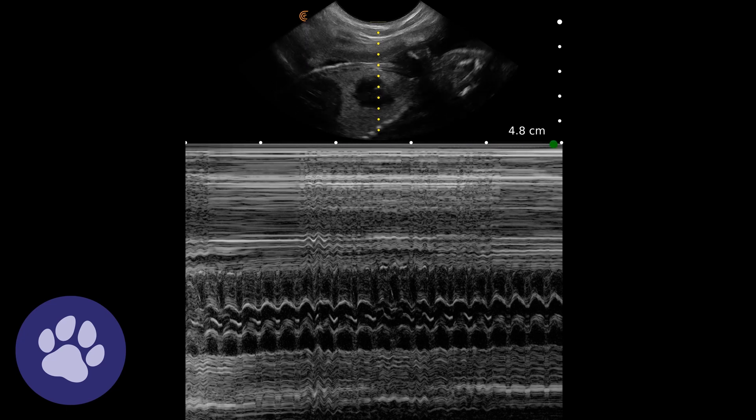To do that we just need to freeze our M-mode image and then take two measurements. I've taken two points at the same point of the heartbeat, so we can see the heart contracting and relaxing, contracting and relaxing. Take them at two points that are the same. You need to know whether your particular machine looks at one heartbeat or two to get an accurate reading.